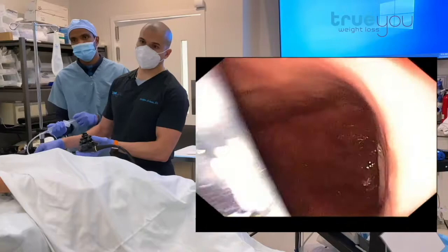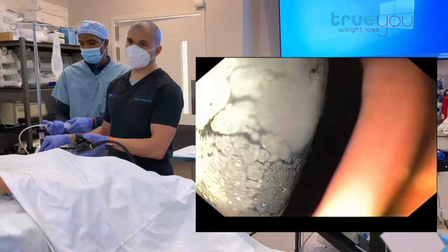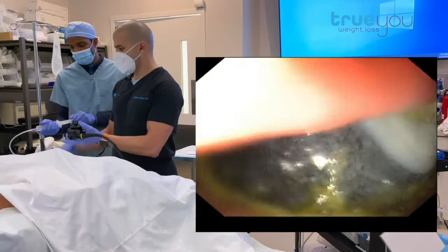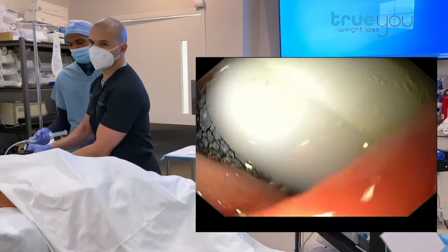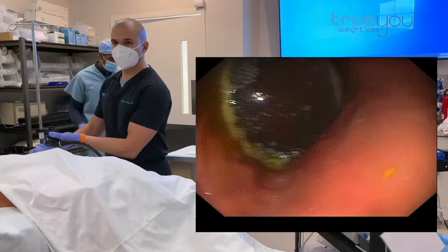Let's go ahead and put 10 in total — 500cc looks appropriate for her. I can easily slide the scope by. So we're finished. We'll detach this catheter — it's quite simple, we'll just pull it off. We'll take a peek at our balloon: it has a self-sealing valve, this cannot leak, it won't leak — it's nearly indestructible.